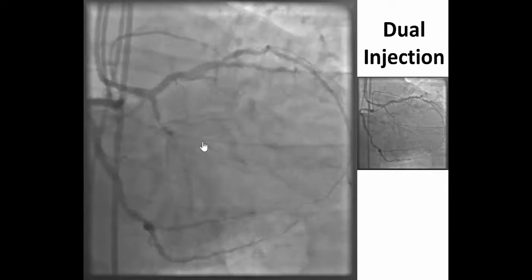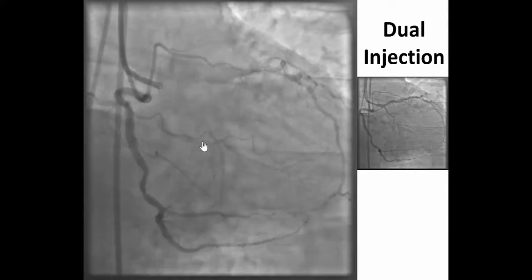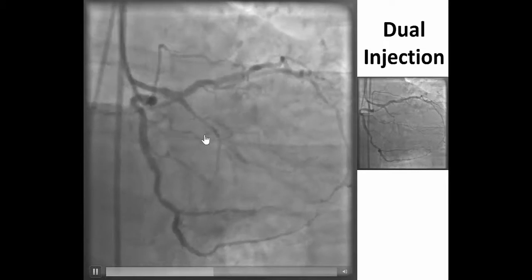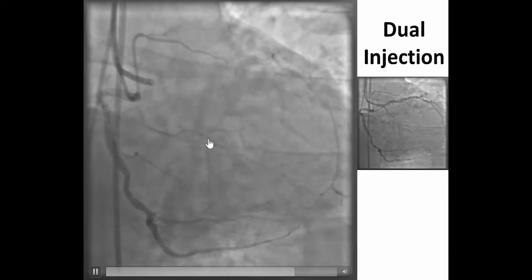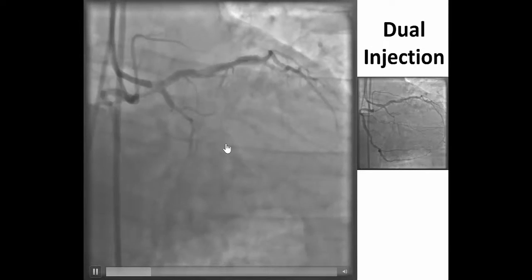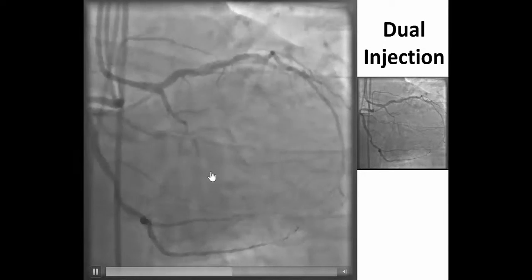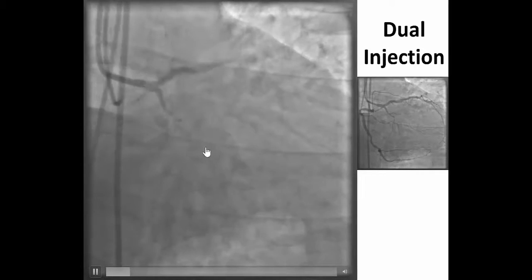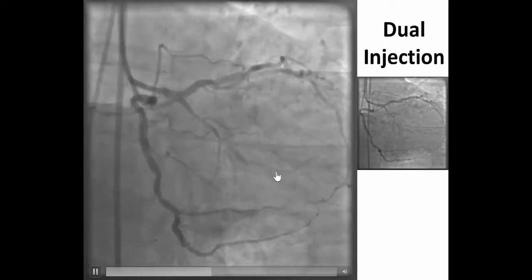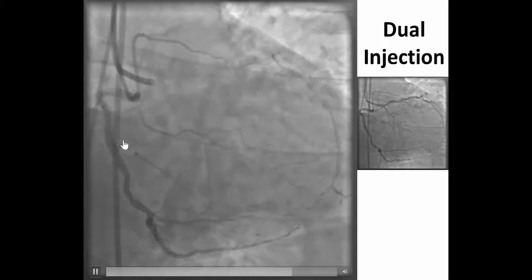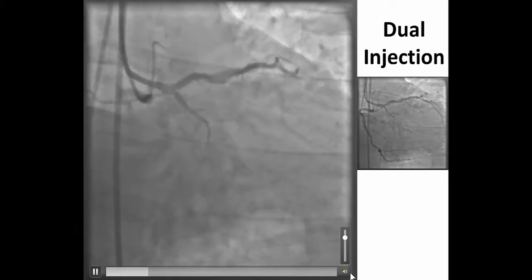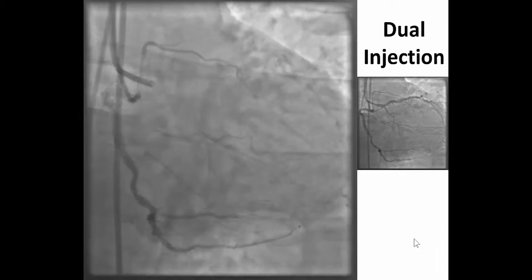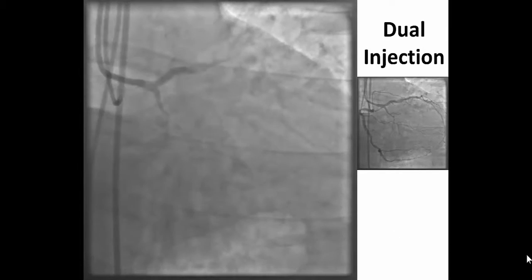This is the dual injection that illustrates the CTO characteristics. We have the ambiguous proximal cap with the side branch at the proximal cap. It appears to be fairly short with an occlusion length of 10–20 mm. There is a bifurcation on the distal cap with the distal vessel being relatively small but probably a good-sized vessel. The collaterals are mainly epicardial from the right coronary artery and don't appear particularly favorable for retrograde crossing.